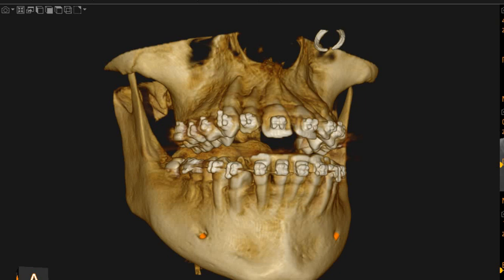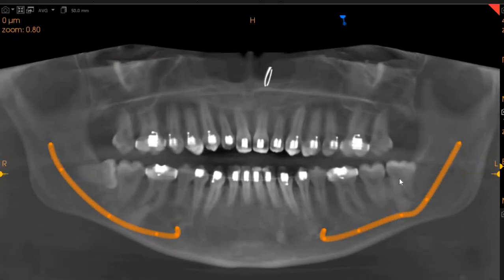Welcome. Ultrascan Diagnostics here. This is the CBCT of the patient that you had requested. The area of interest is the multilocular radiolucencies as the doctor indicated in the mandible.